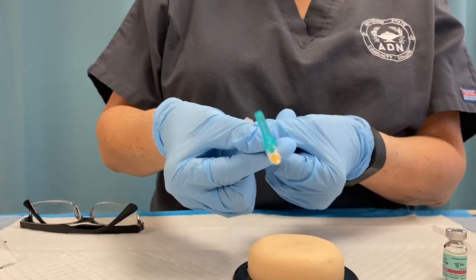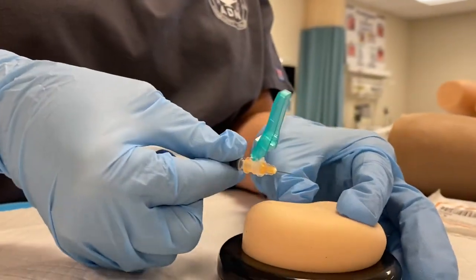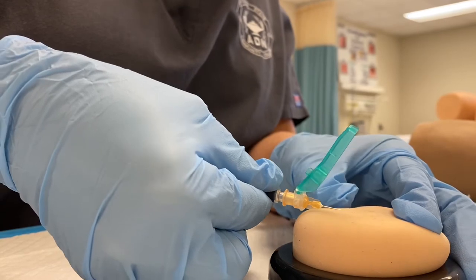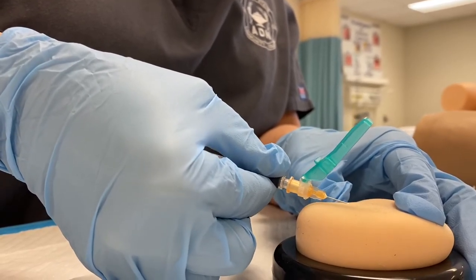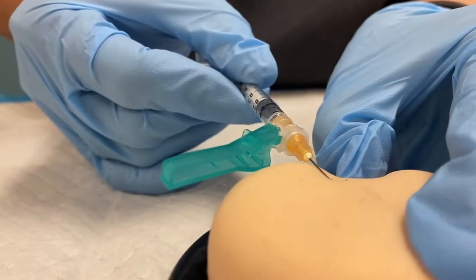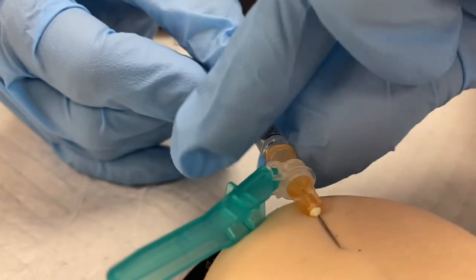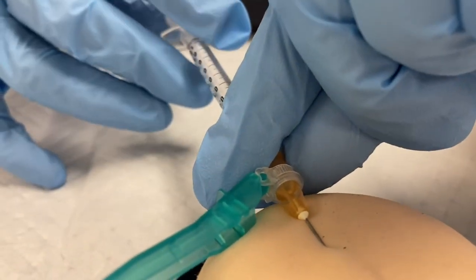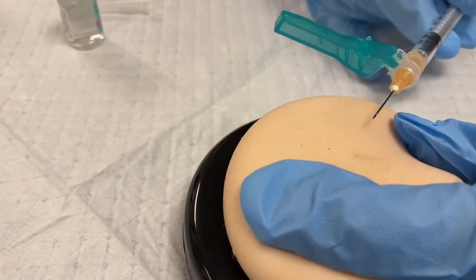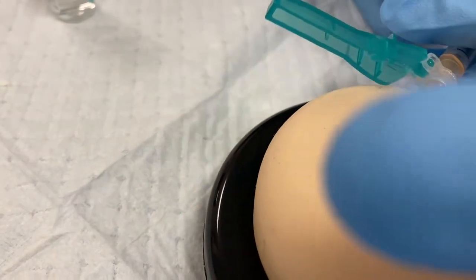You're going to use your index finger underneath the syringe, your thumb on top to stabilize your syringe. 5 to 15 degrees would be almost parallel — 5 would be just off from the skin. If you've got someone who has a lot of skin, that might be more of a 15 degree angle. Bevel up, just enough under that skin that the bevel is no longer showing. I'm going to stabilize my needle and push. Your bevel's up. You pull the skin taut. You insert the bevel into the dermis just enough that it is hidden, and inject the medication.